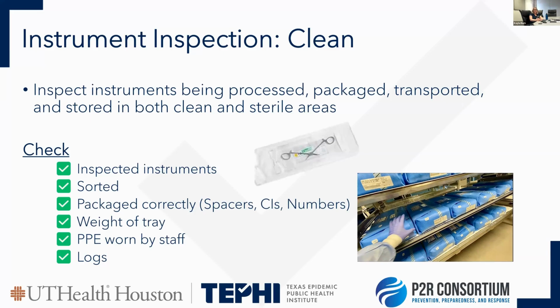There's also not a staff member from the decontam side going onto the clean side. There should be separate staff for this area. And if there's not, then what is the process for changing PPE going from one area to the other? Because you have a very dirty place to a clean place, making sure that we don't have contamination due to environmental contamination of walking, touching certain areas within that, that our staff kind of stay separate.